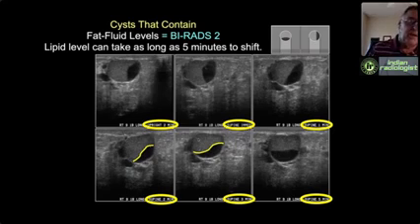This is important for sonographers because if they're efficient, the patient is upright in the waiting room. They put her on the table, and if they have work lists so they can pull up the patient's information very quickly, they may well have scanned the patient sooner than 5 minutes. So sonographers are frequently going to see this sigmoid shape.